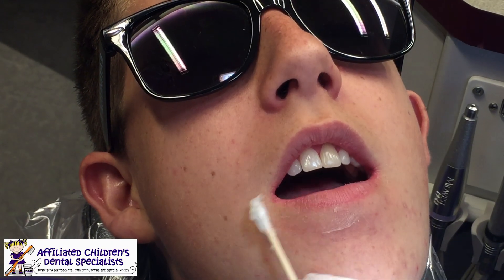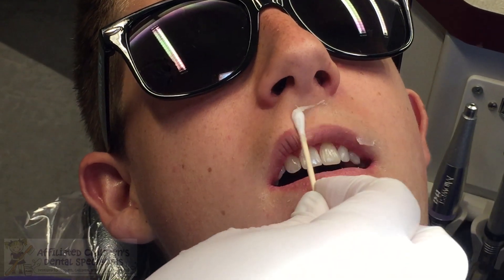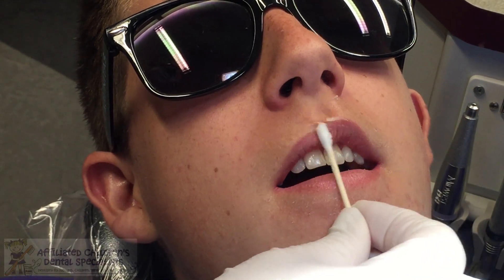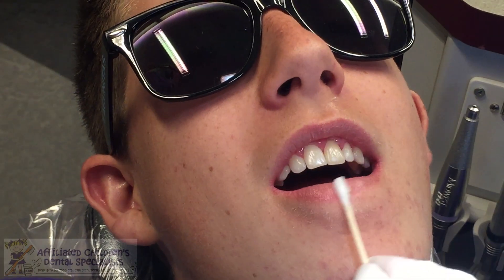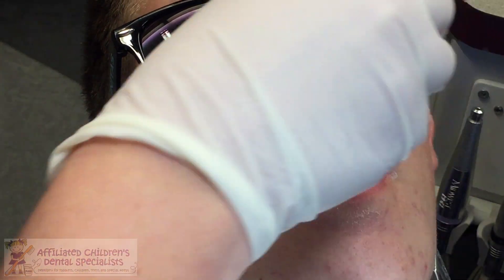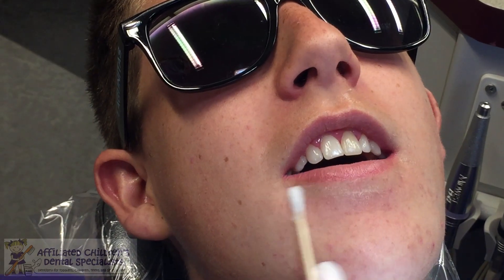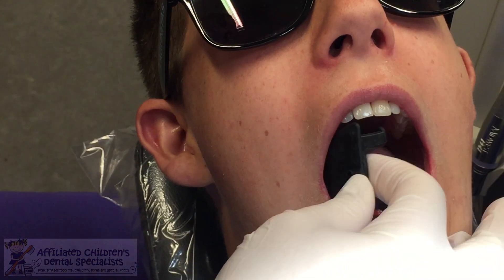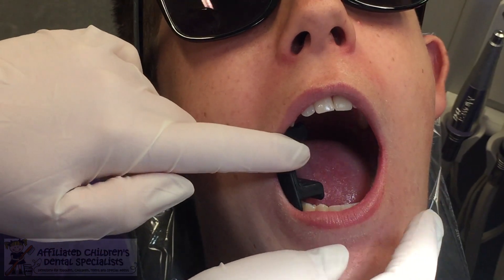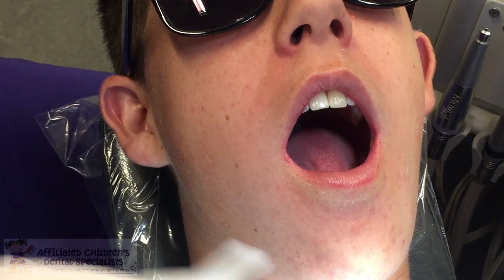All right, so we're going to put some Vaseline on your lips and your skin. I'm going to put a little mouth pillow in there. Can you open big? And then just bite down on that. And then we're going to put a dry angle.